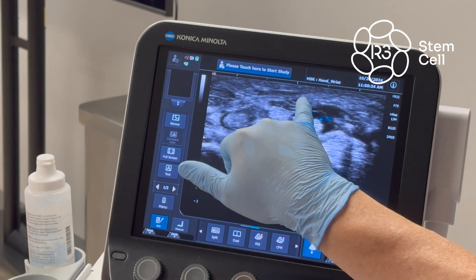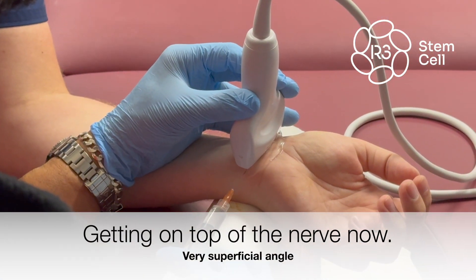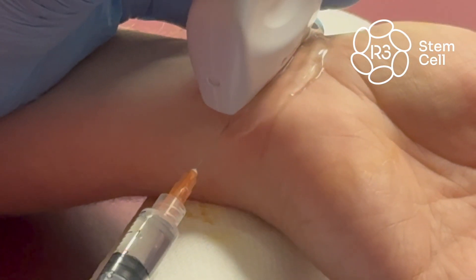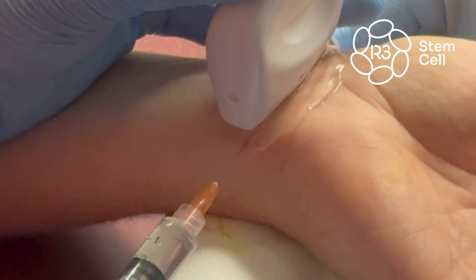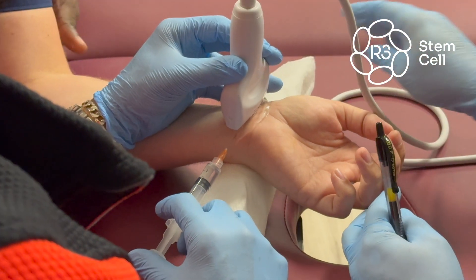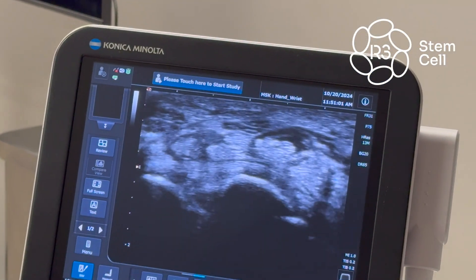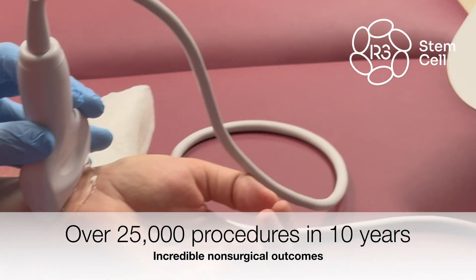Come back and flatten off — the goal space is right up on top of here, we're very superficial. There's a bottle and a paper towel under me, I can't get any lower. So I'm going to take this just over just a little bit. There we go — align that needle really well. Angle up a little more — come out just a little bit and angle up just a little more.